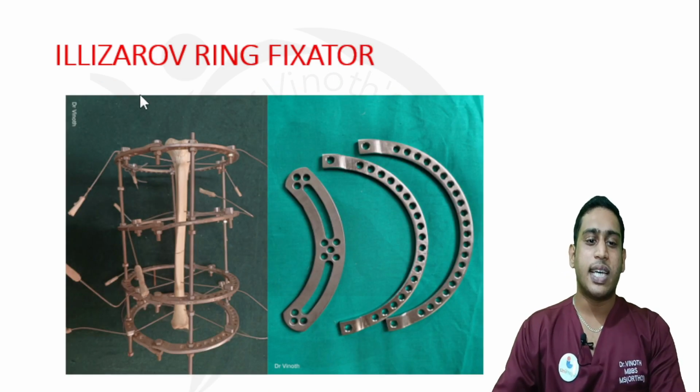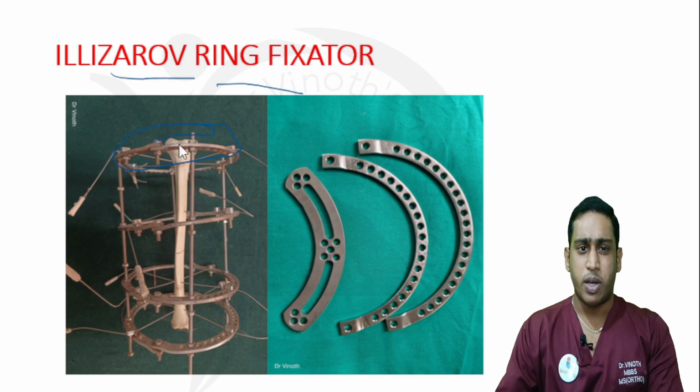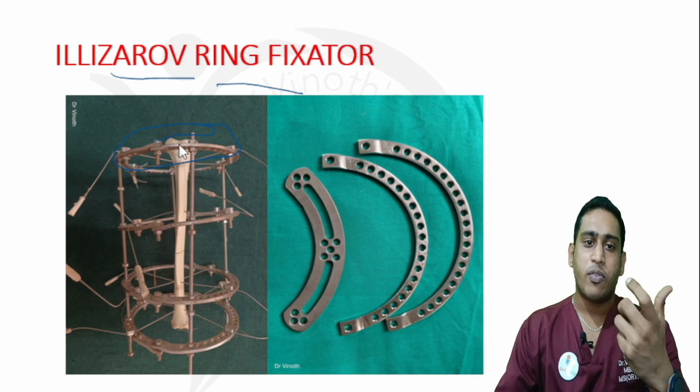So coming to the second system, the Ilizarov ring fixator. This is the component; these are the half rings that will be combined to form a full ring. Regarding the Ilizarov indication, principle, everything I have explained already in the management of fracture chapter. You can go through it for further explanation.